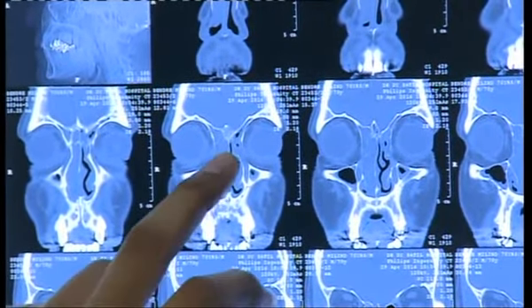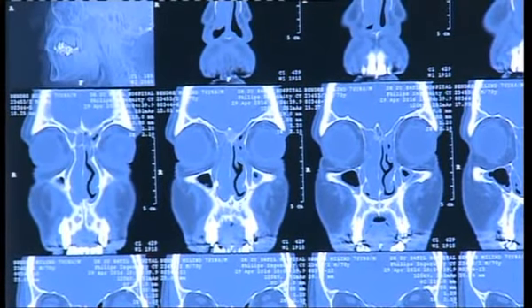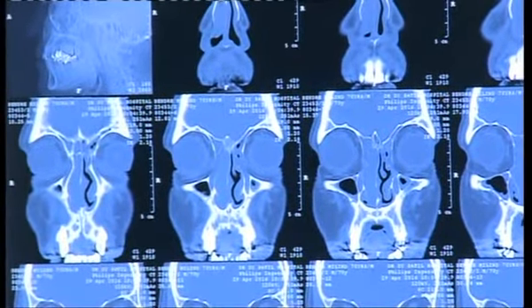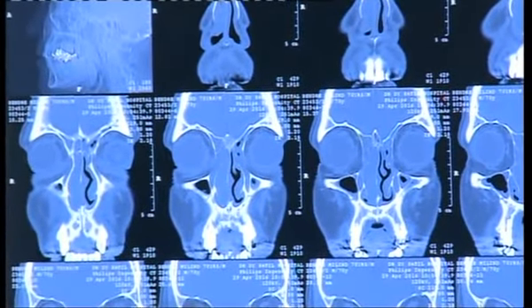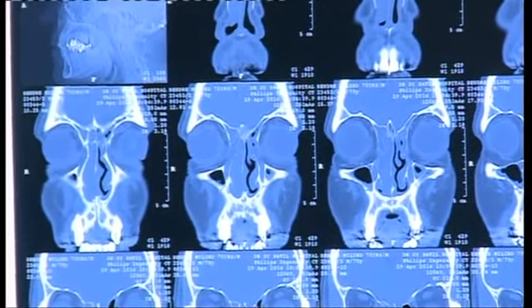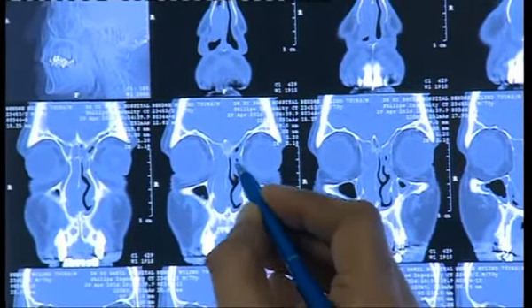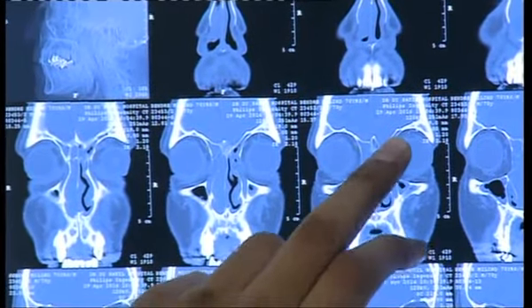In the frontal recess, we need to know what kind of cellularity there is, and this is best depicted by the sagittal reconstruction images. Here you can't make out that kind of three-dimensional scenario on the coronal alone. But yes, agger nasi cells are the most important, and these are one of the determinants of frontal sinus outflow, how the frontal sinus is going to drain into the middle meatus. So this is the anteriormost picture. Now going behind in the frontal recess, we are still in the frontal recess.